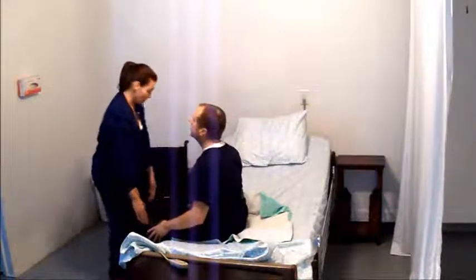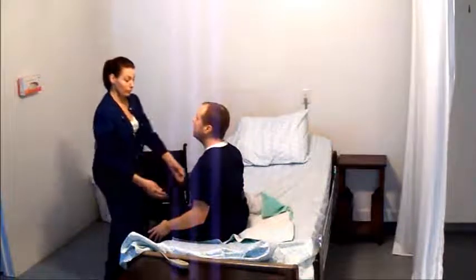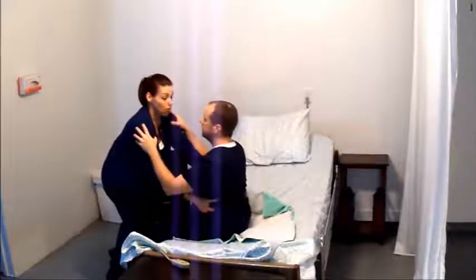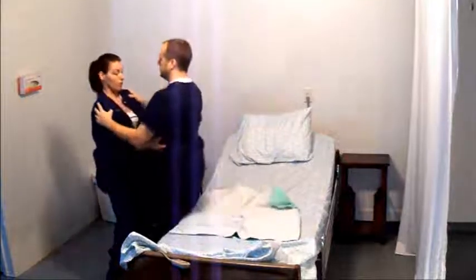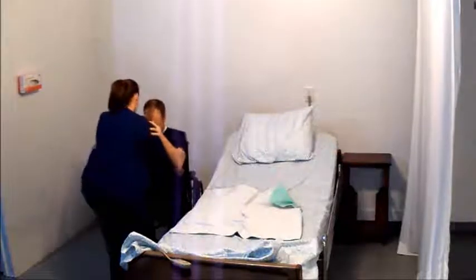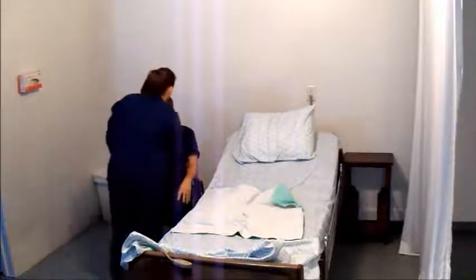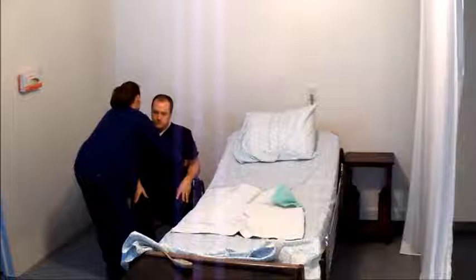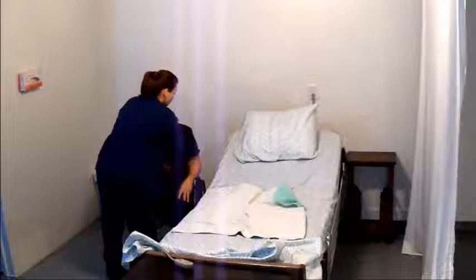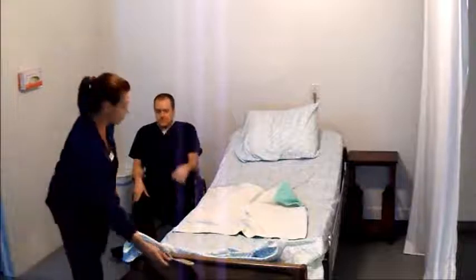Support the resident to provide for controlled, gentle lowering into the seat of the wheelchair. Leave the resident positioned in the wheelchair in proper body alignment, hips against the back of the seat and feet on the footrests. Remove the transfer gait belt from the resident's waist without harming the resident when the transfer is completed. Ask the resident about preferences during care. Use standard precautions and infection control measures when providing care. Ask the resident about comfort or needs during care or before care is completed. Promote residents' rights during care. Promote resident safety during care.